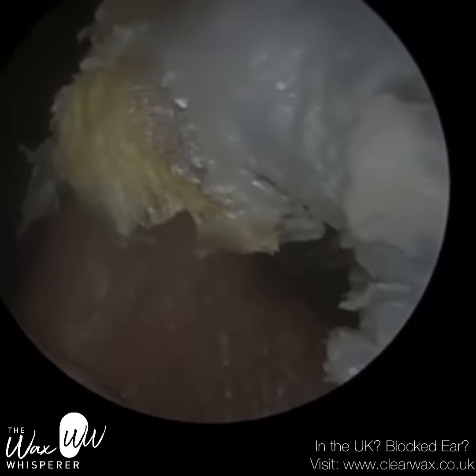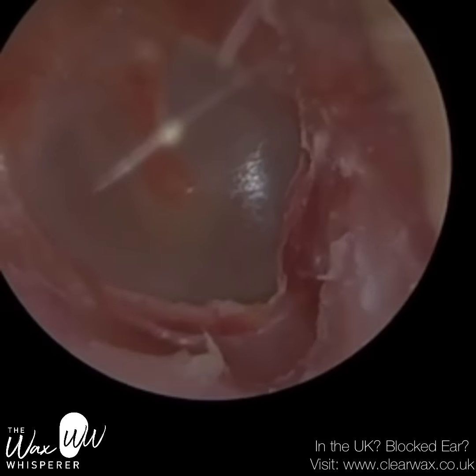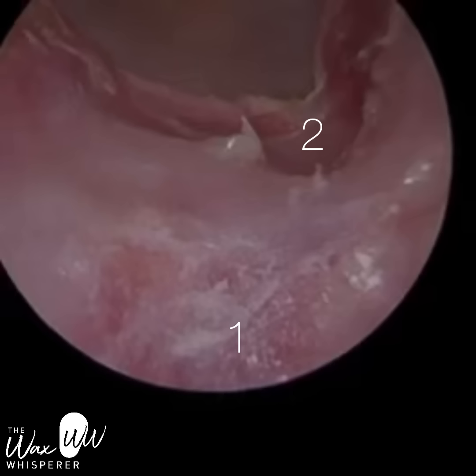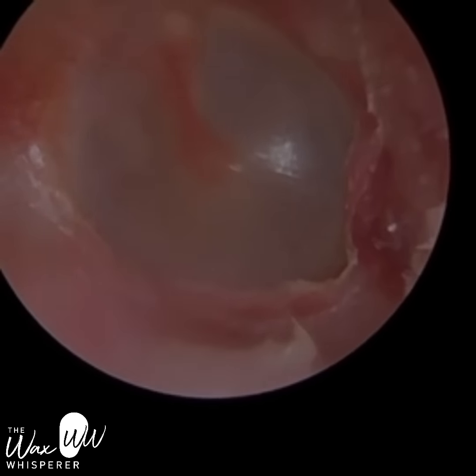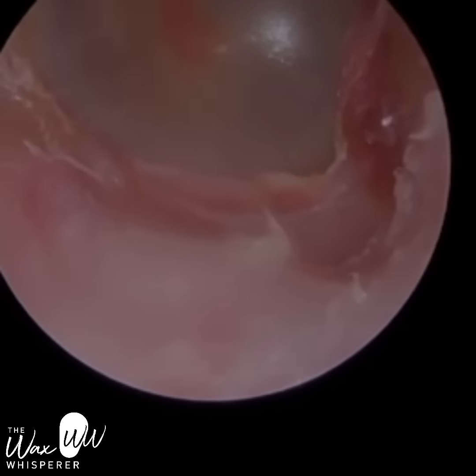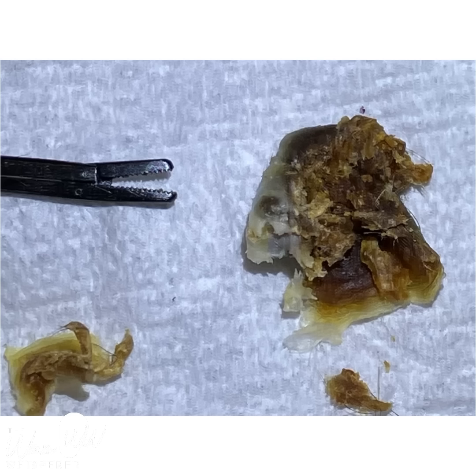You can see that fresh layer of dead skin that's lining the base of that plug. And these are the two widenings. I'm just going to freeze this. So you've got widening one there, probably just where the cartilage meets the bony part. So you've got these ridges, and the second part's a bit deeper. Now, it's a bit sore there, but deeper on, when we remove this skin you can get blistering. There's that plug, and I've put the forceps there side by side as a means of comparison. You can see it's quite a sizable chunk. And immediately the patient felt significantly better. They felt that pressure, that fullness had gone.